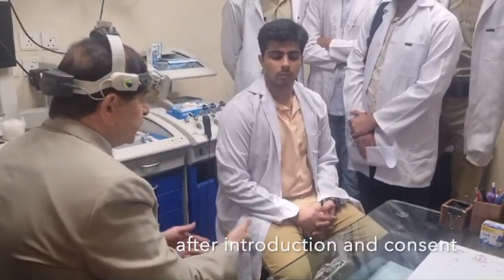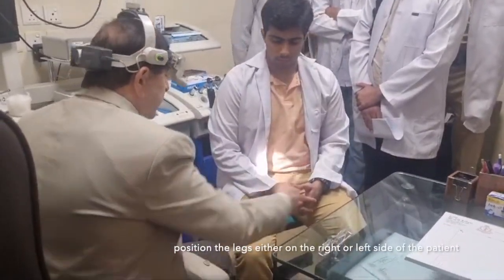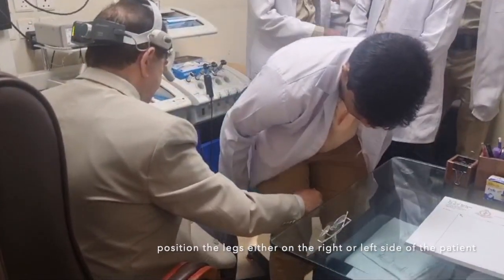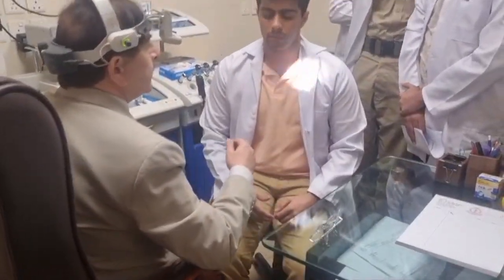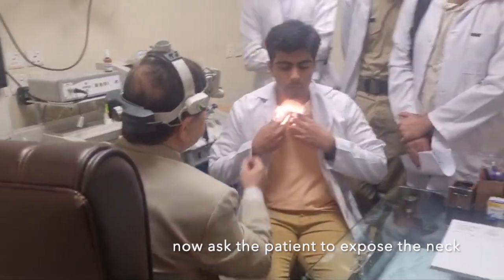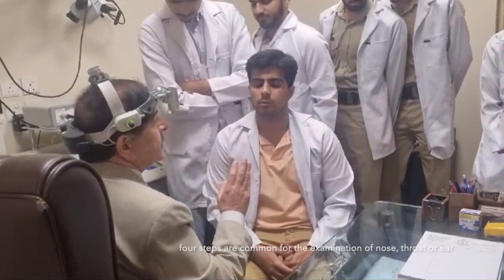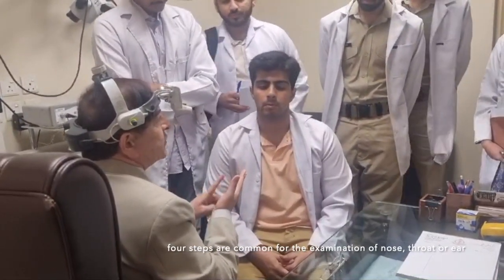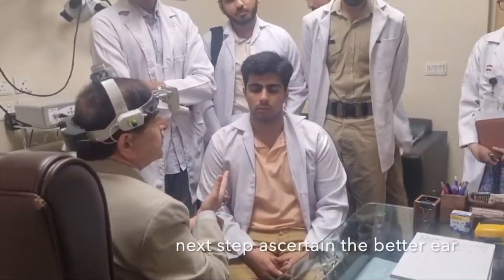The third step is positioning — either the legs go on one side or the other side, so the legs are on this side. Next comes exposure. I have told you that four steps are common for all examinations, whether you are doing ear, nose, and throat.